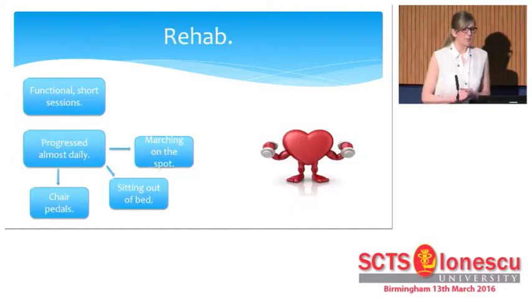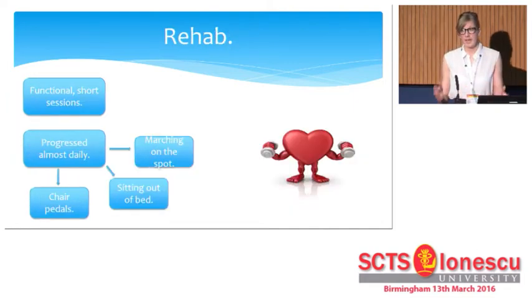Okay, so we were able to start our rehab sessions the day after the patient was cannulated, and we started with quite short functional sessions to see how the patient would cope and also to see how the ECMO would cope. So we started with things like moving in the bed, sitting on the edge of the bed, standing and step transferring to the chair.